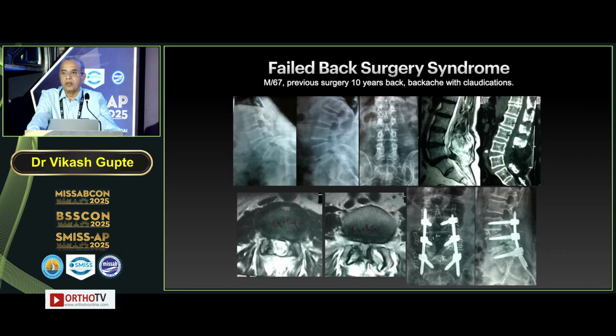Failed back surgery syndrome: this is a 10-year-old open laminectomy, a 67-year-old male who came with instability. We didn't go through the scar; we did percutaneous pedicle screw fixation with tubular cage fixation.